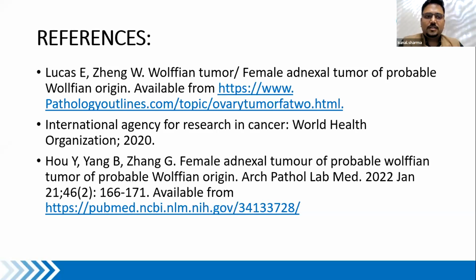Okay, so I think this is quite an interesting case, with very, very close differentials. Abha ma'am, any thoughts from your side?